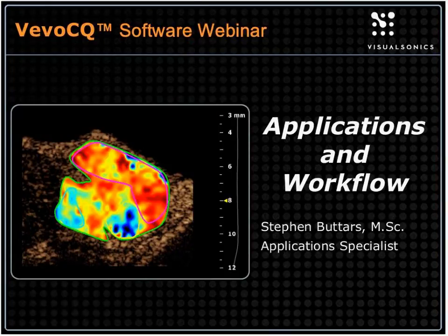He'll then take us through an interactive session running the VevoCQ software with some example data sets to hopefully give you a good sense of the typical workflow and tips and tricks for acquisition and data analysis.